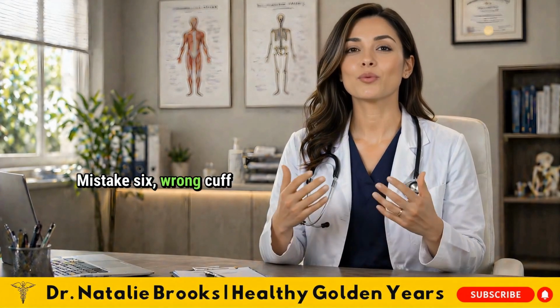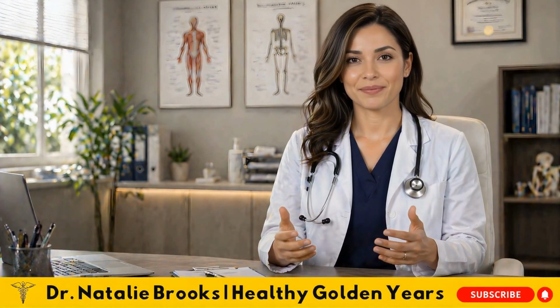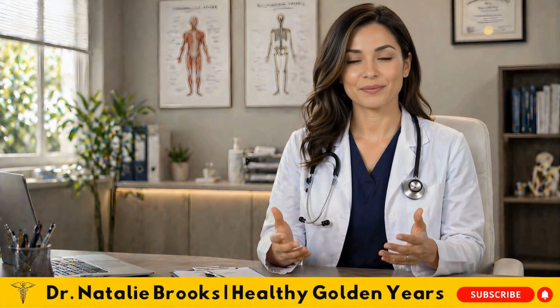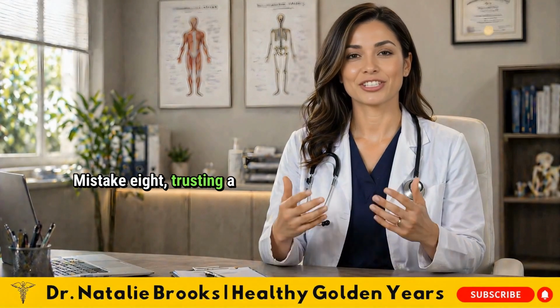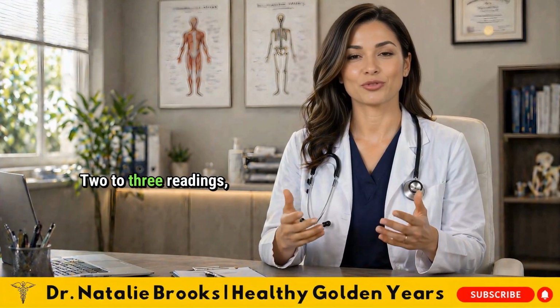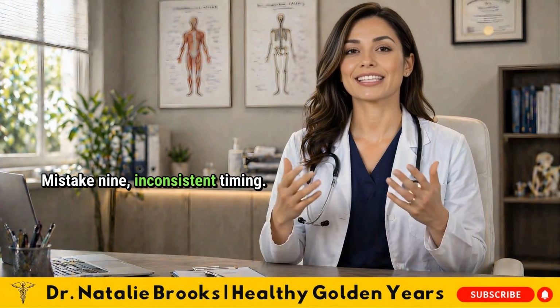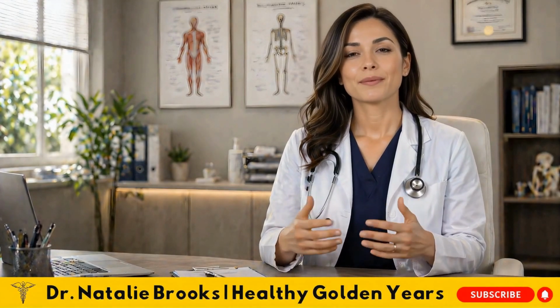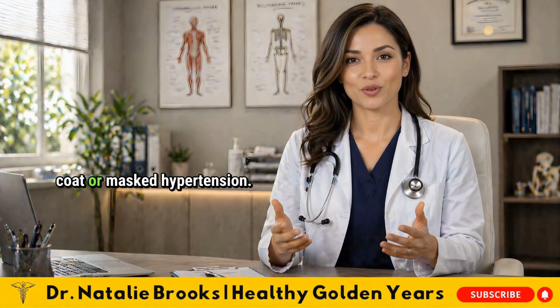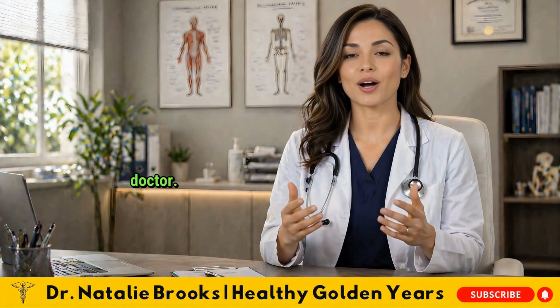Mistake 6, wrong cuff size. Confirm your arm circumference and match the cuff. Mistake 7, talking or moving. Complete stillness and silence during the reading. Mistake 8, trusting a single reading. 2 to 3 readings, average the last 2. Mistake 9, inconsistent timing. Same time every day before medication and food. Mistake 10, ignoring white coat or masked hypertension. Discuss home versus clinic reading discrepancies with your doctor.